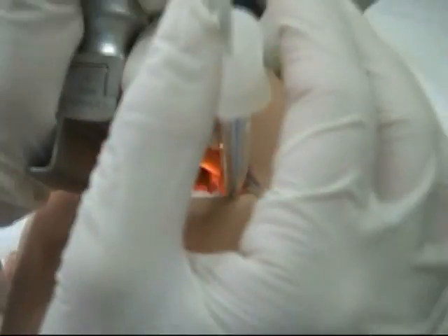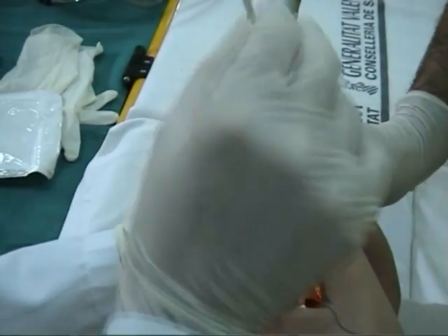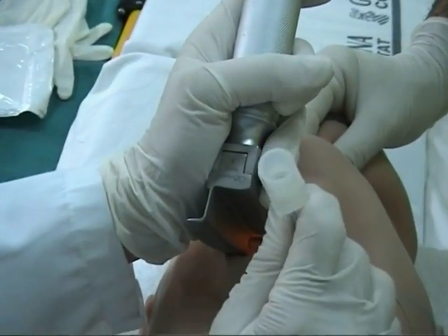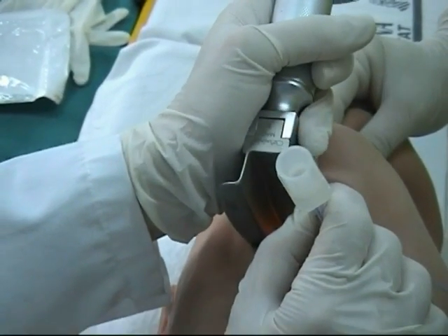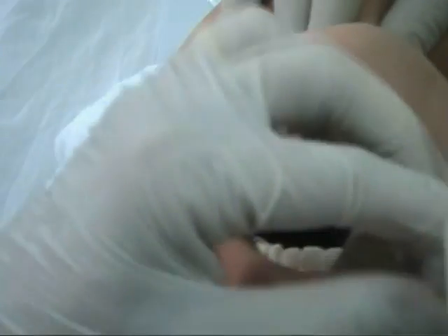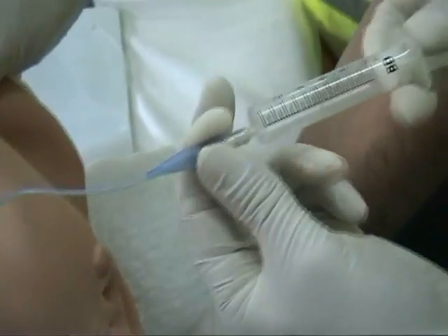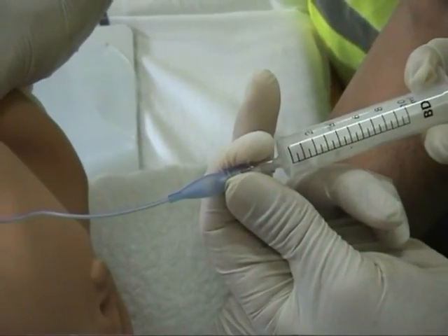Remove the stylet and advance the tube until the balloon is 3 to 4 centimeters beyond the vocal cords. Remove the laryngoscope and inflate the endotracheal tube balloon with air to prevent air leaking during the ventilation with the bag valve mask.